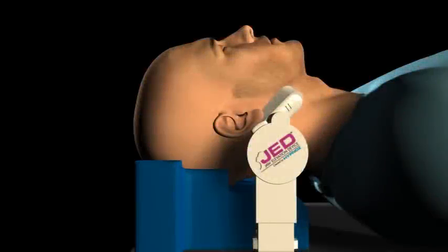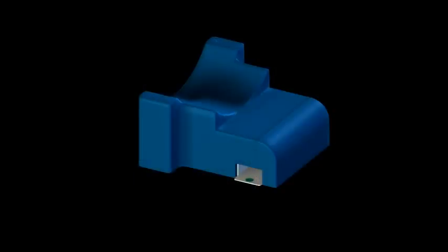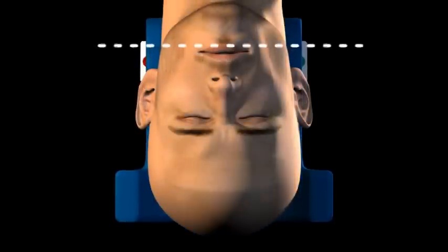Optimal placement of the JED is accomplished by positioning the patient's head on the head support. Next, adjust the vertical support arms so that the center of the mandible cup cradles the angle of the mandible, while rotating the head back and advancing the mandible. Center the patient's head on top of the JED head support, aligning the patient's lips with the positioning line.